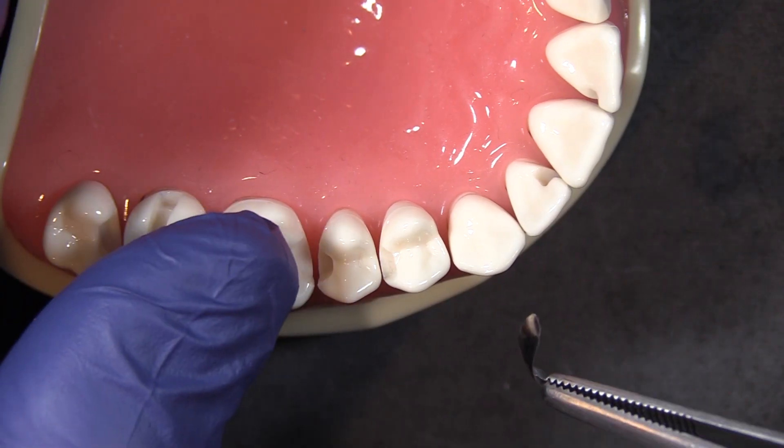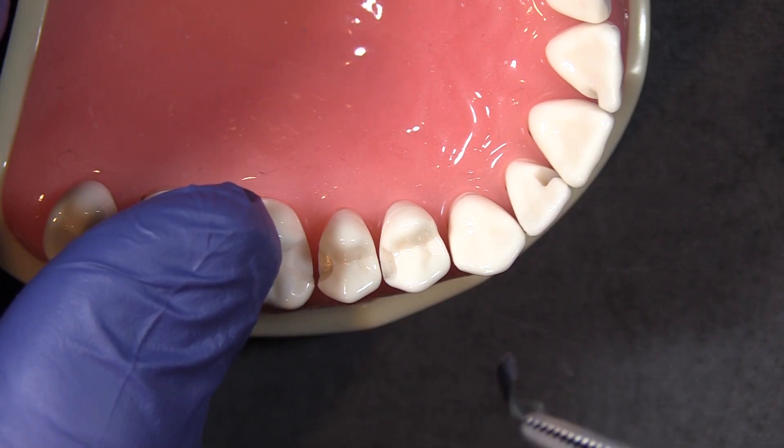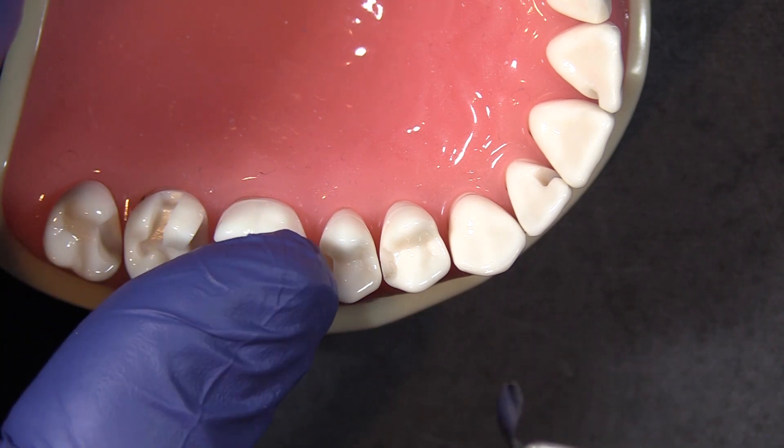Hi, this is Kevin with Garrison Dental Solutions and I have three quick tips on how to place the sectional matrix band through a tight contact.